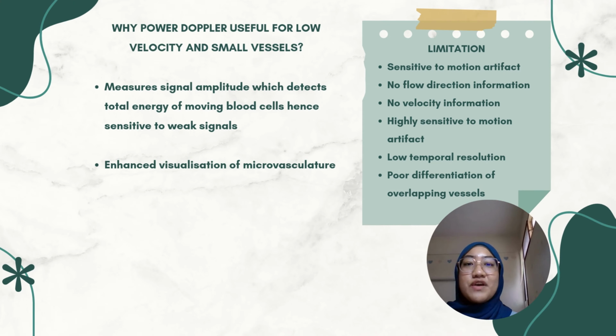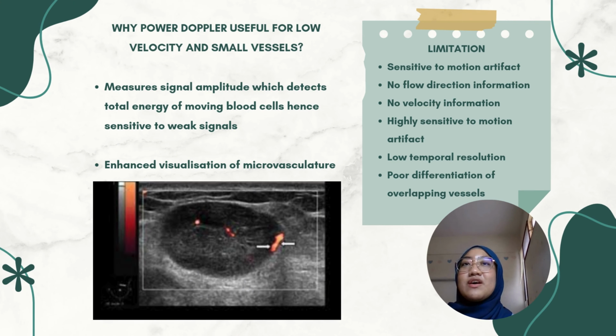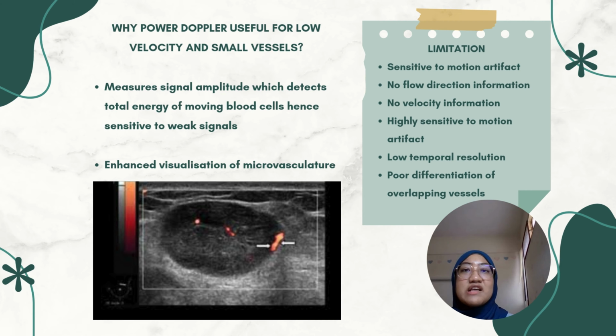Power Doppler is very useful for low velocity and small vessels visualization. This is because it measures signal amplitude which detects total energy even for weak signals. So it enhances the visualization of microvasculature.